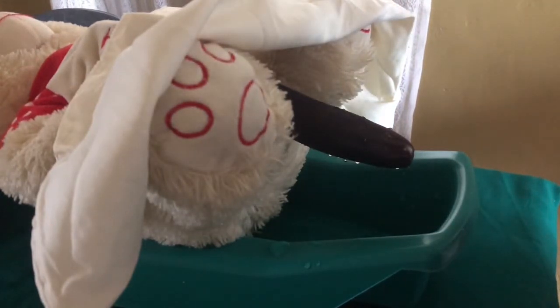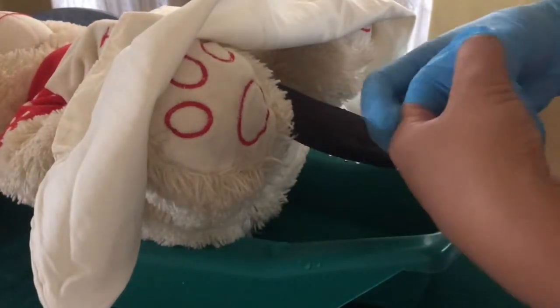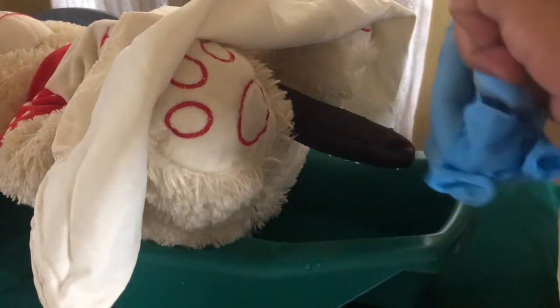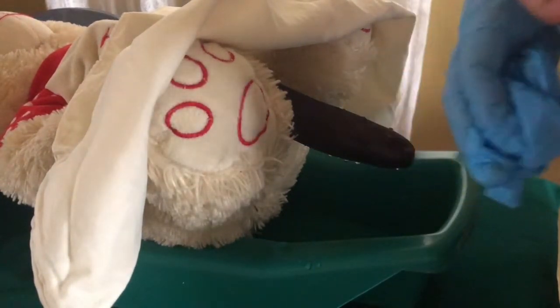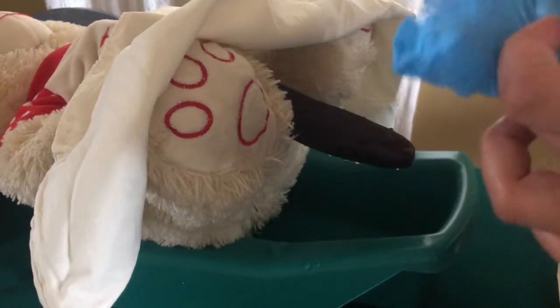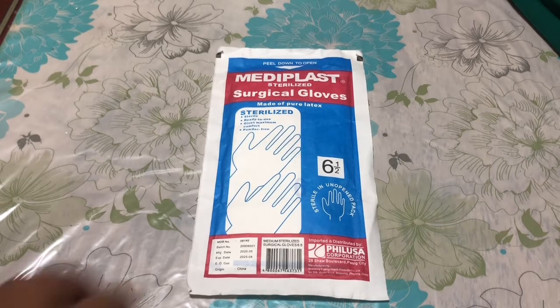And discard working gloves after cleaning the perineal area. Put on sterile gloves.